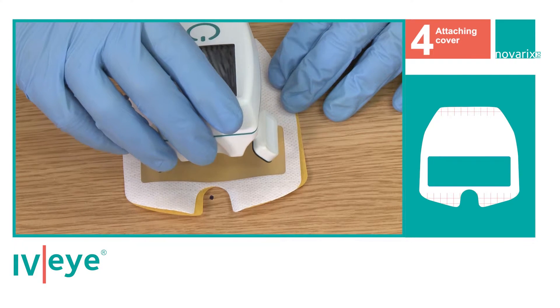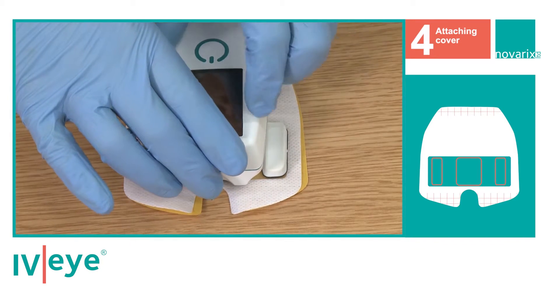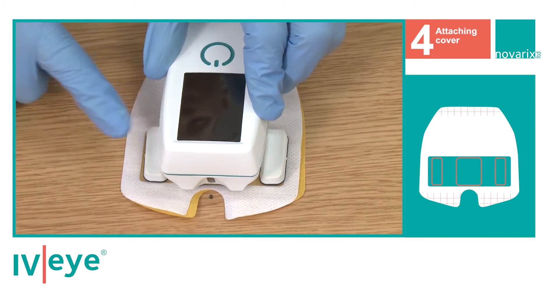Then position the IVI so the front wings of the device sit down within the clear window of the cover. A little pressure may be required.